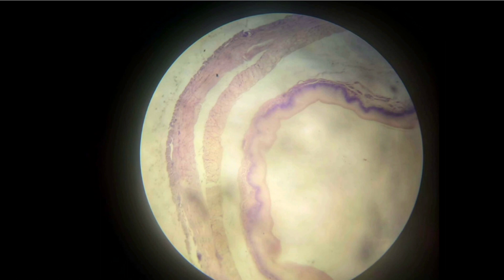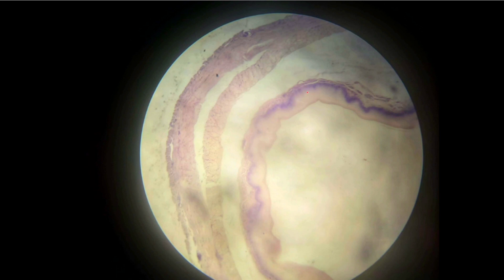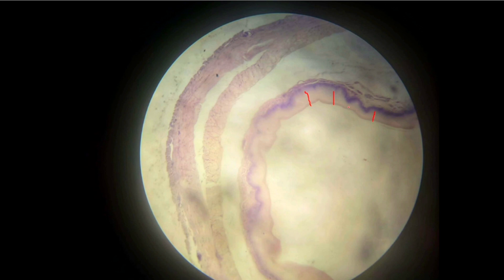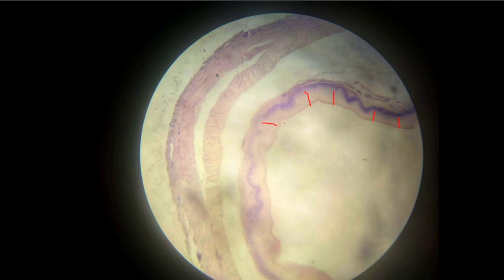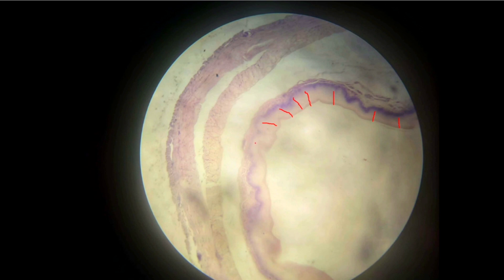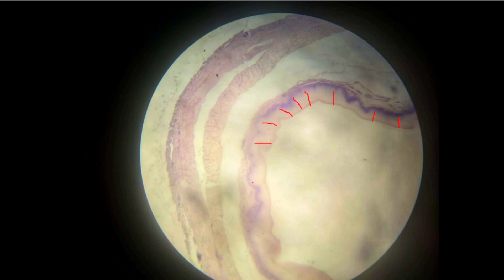Take a slide. Very interesting. Is it a simple layer or stratified layer? So what is the lining epithelium of large intestine? Simple columnar. So it looks like it is not matching the theoretical information, so it is not the slide of large intestine. It is non-keratinized stratified squamous epithelium.